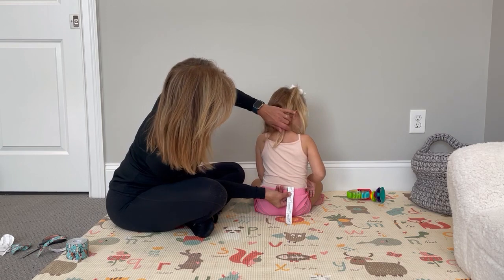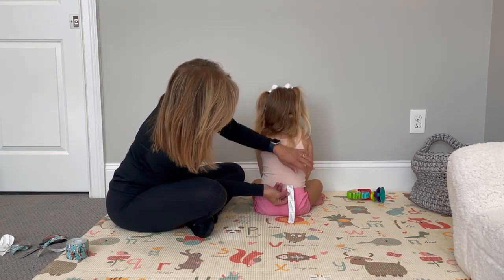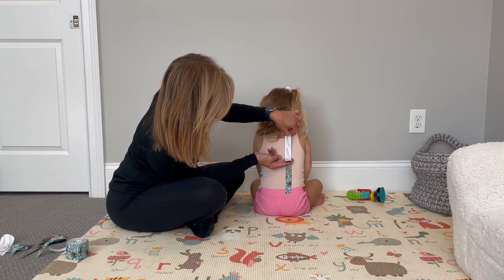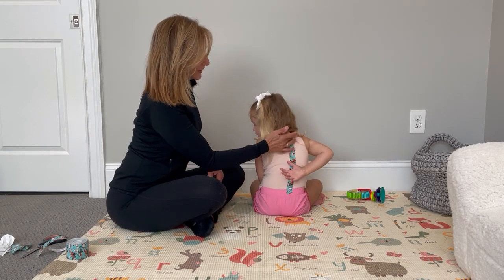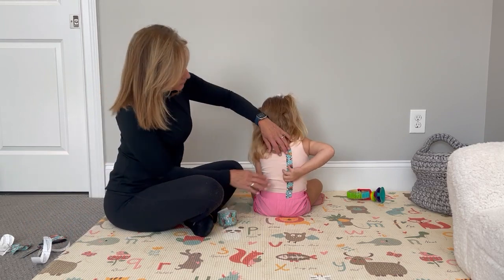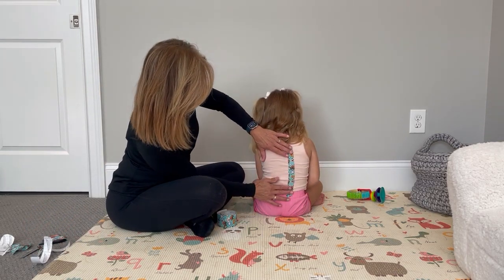Okay, face the wall, Camden, so we can look straight at the wall. Head straight, look right here. And all I'm going to do is paper off tension right up the side of the spine. So as high as you need to go, you could even go all the way up to the neck. Now, you would do both sides. We're not going to take it off yet. We're going to do one more piece.